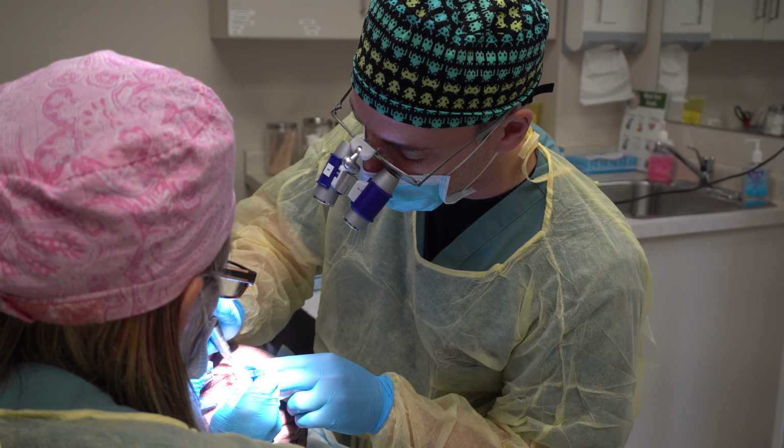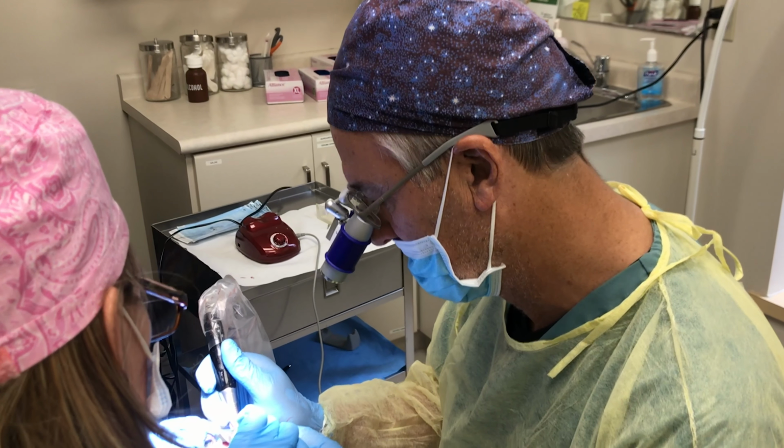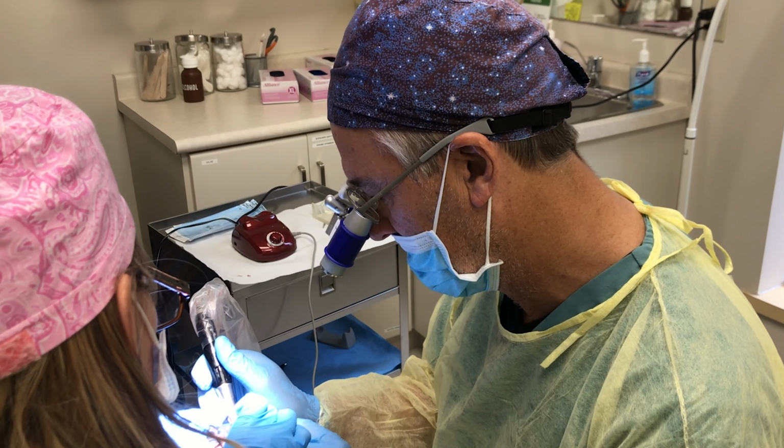The surgeon excises the graft. Our assistant, our nurse, will then take some forceps and gently move the grafts from the donor area into a storage medium, where it'll then go directly to one of our technicians to examine under the microscope, and then it will stay for a brief time in that storage medium until it's placed into the recipient area in the patient's head. People will walk out of here with some visible scabs from the implanted grafts, and we give everyone a hat to cover up with. But they'll walk out feeling great under their own power. They'll drive themselves home because there's no sedation, local anesthetic only.